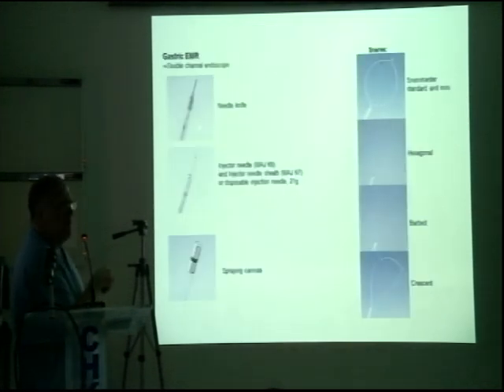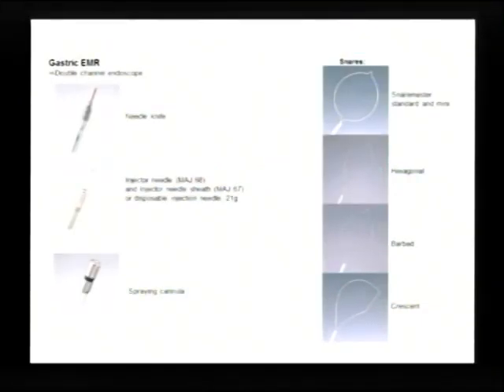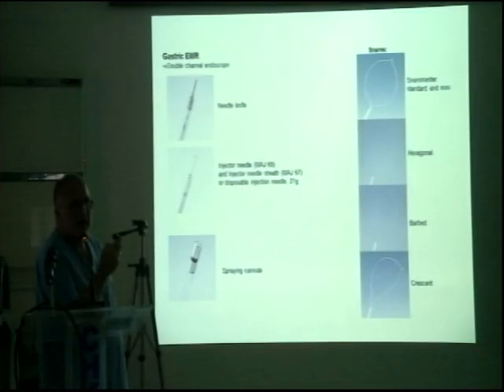There are different types of equipment. Can you see this here? Needle knife. Any of you guys using it? Again, I'd invite you to the office, because this is not appropriate.